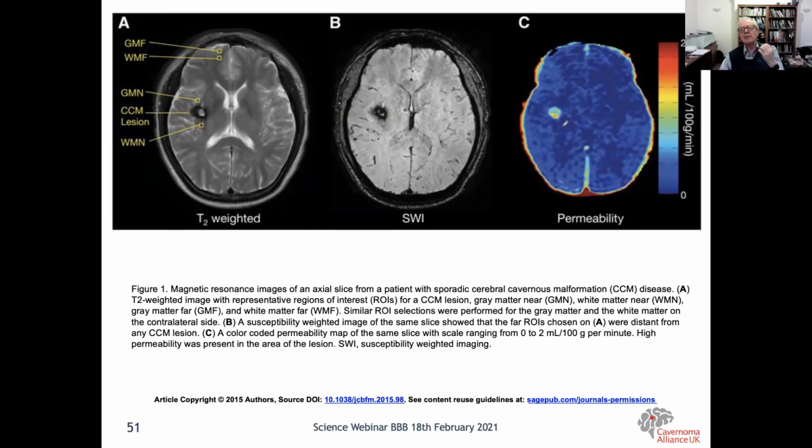Because gadolinium leaches out through the structures, by comparing what it was like originally with what it's like after 10 minutes with gadolinium exposure, you can color it in the computer to show how rapidly the blood is flowing out of that cavernoma into the main tissue.